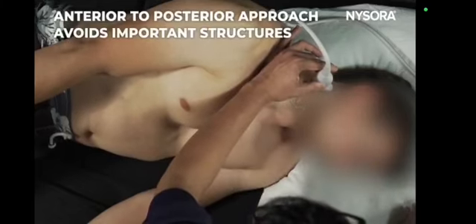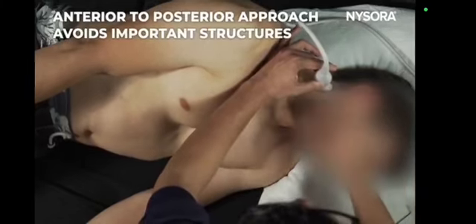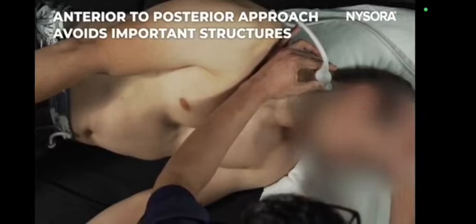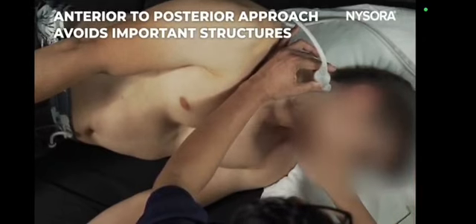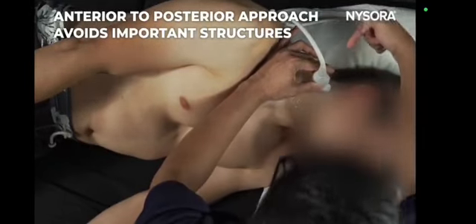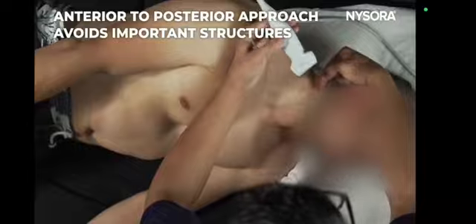The reason to do the anterior to posterior injection is because you have all the important structures like the vertebral artery, cervical nerve root, and carotid artery, all situated anteriorly. So if you try and put the needle from posterior to anterior, you're heading towards all those vital structures. So it's always important to put the needle from anterior to posterior. So that's how you would perform cervical medial branch blocks.